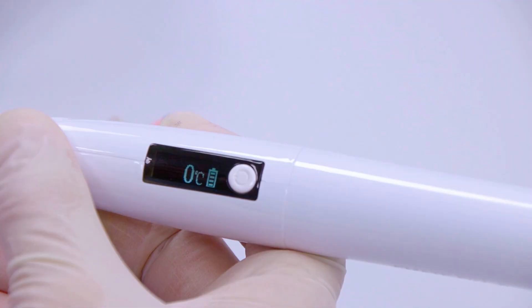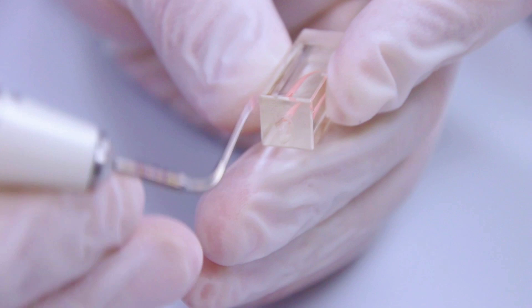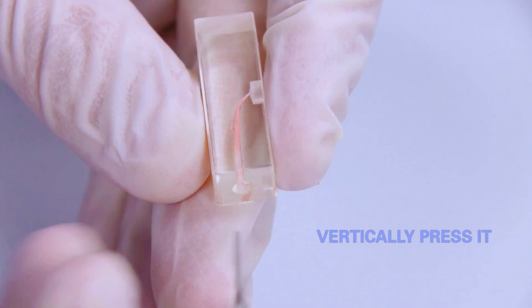Cut off the end of the gutta percha. Melt the main tip of gutta percha, then vertically press it.